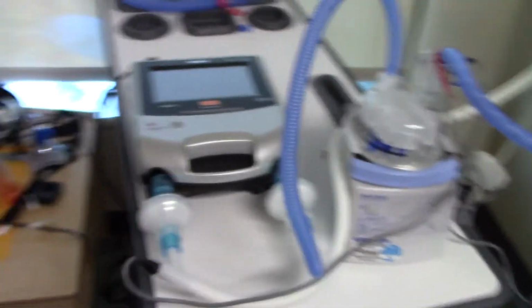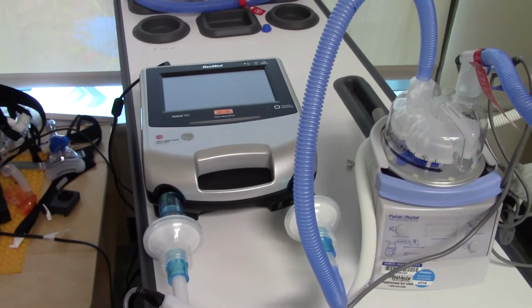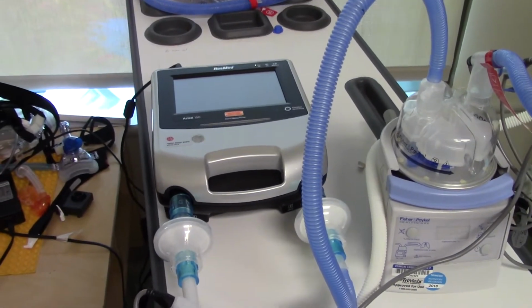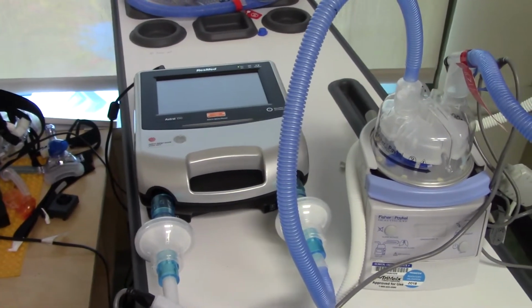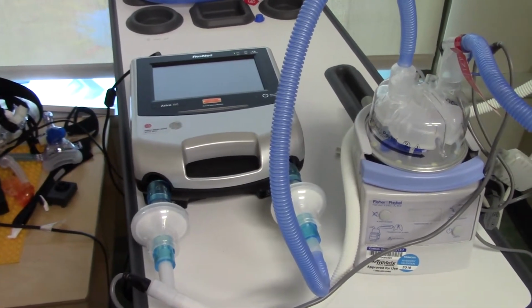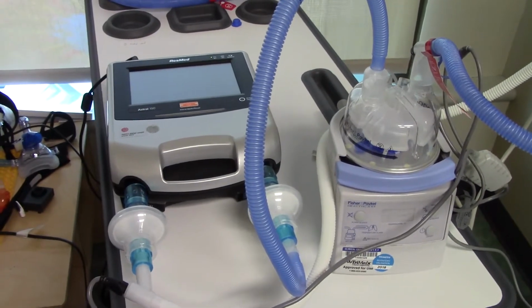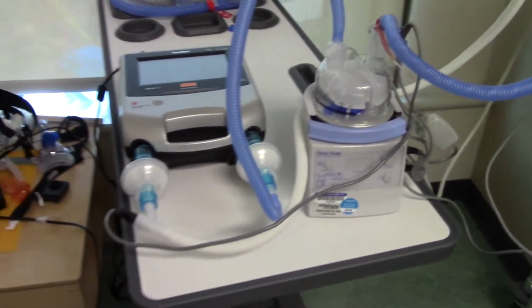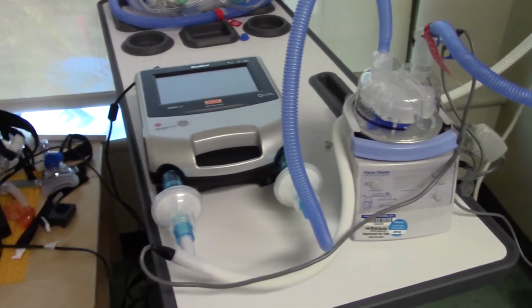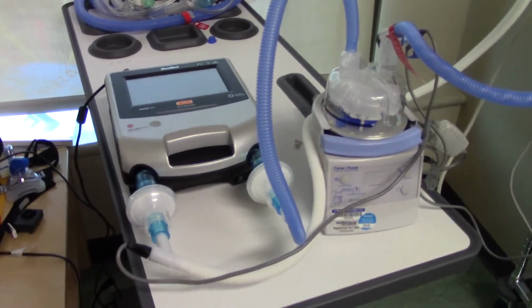Today, what we're going to talk about is using our Astral 150 as a backup vent to the servo in a situation where we would run out of servos, they're all in use, and we have another patient that needs to go on a mechanical ventilator, and this is going to be our option to go to: the Astral 150.